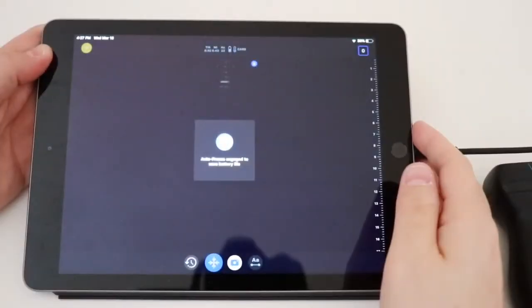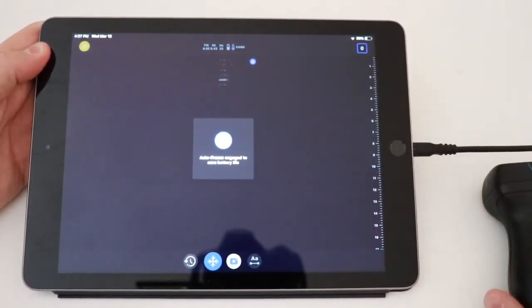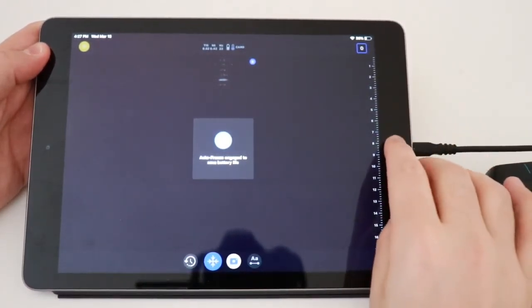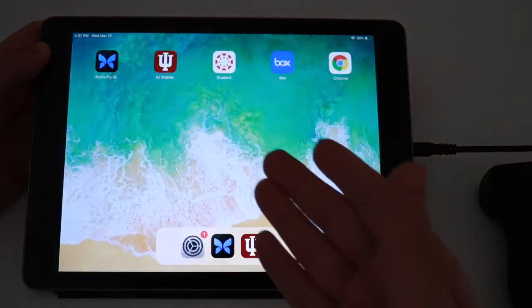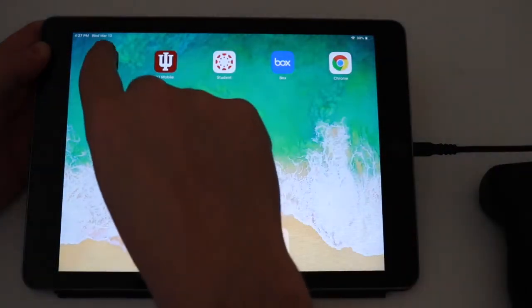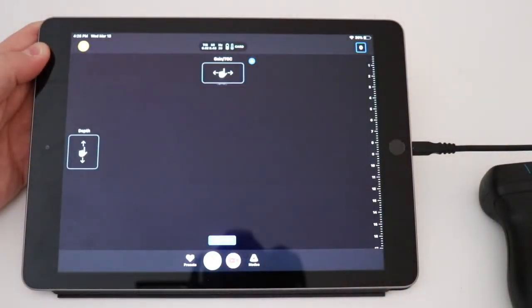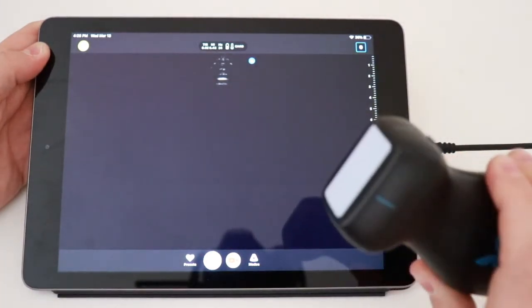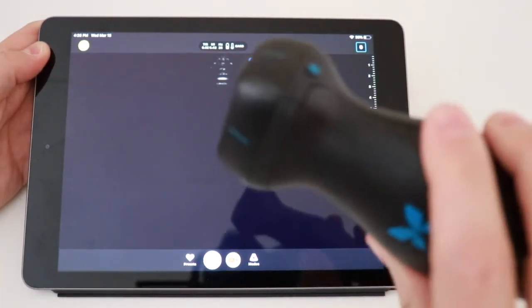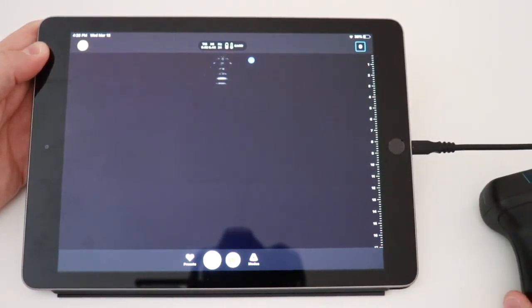Next up, we're going to be talking about the Butterfly IQ. Usually when you put the probe in the iPad, the app automatically comes up. If it doesn't and you need to get to it from the main screen, you just click on this butterfly icon and it'll take you right into the program. The probe itself looks like a phased array probe. It looks very similar. The battery is actually inside. It's a little bit heavier than the Philips Lumify, and it's a little bit more of a versatile probe.